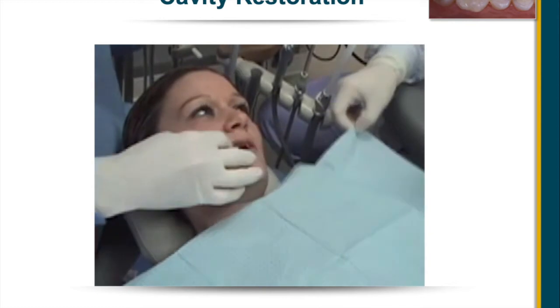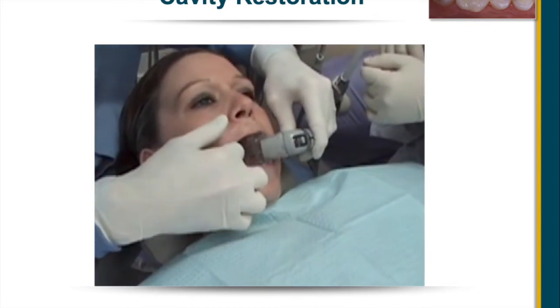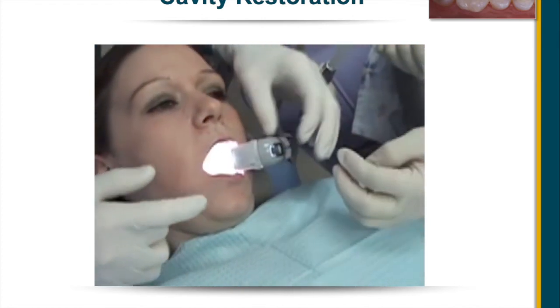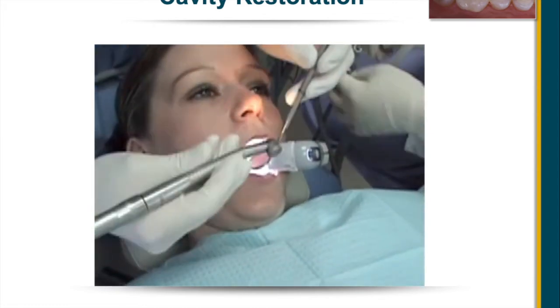We're going to briefly show the ISOLite system, not a commonly used system, but one that is gaining popularity. It is a mouth prop, a cheek retractor, a tongue retractor, a suction system, and a light all in one. It requires special equipment. And again, not all offices have this equipment.